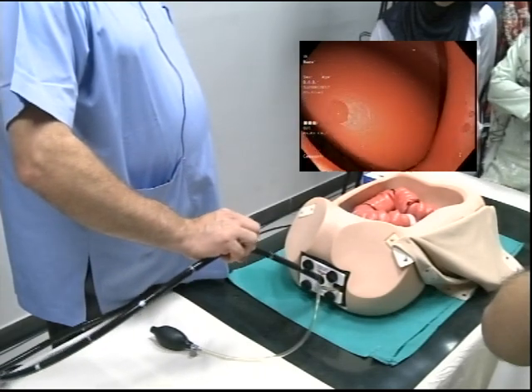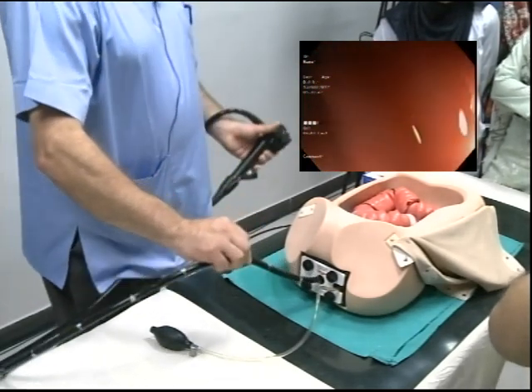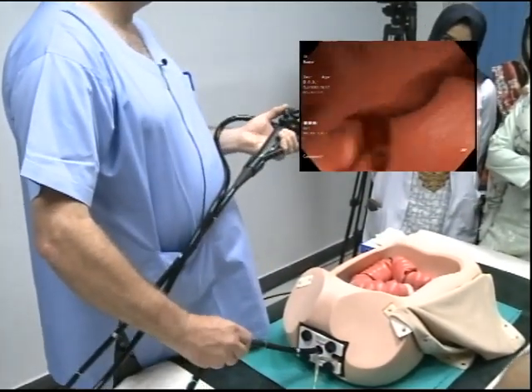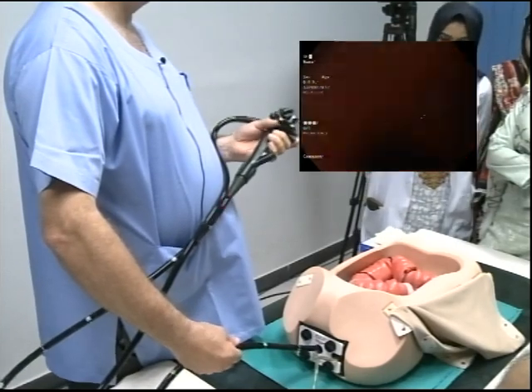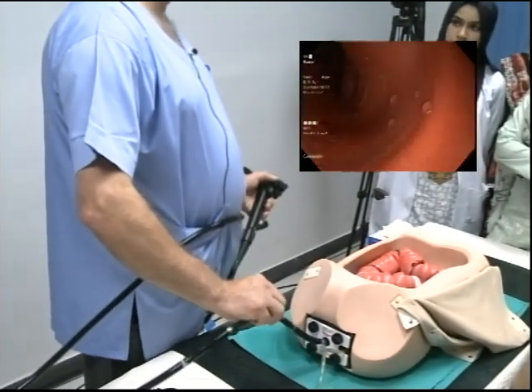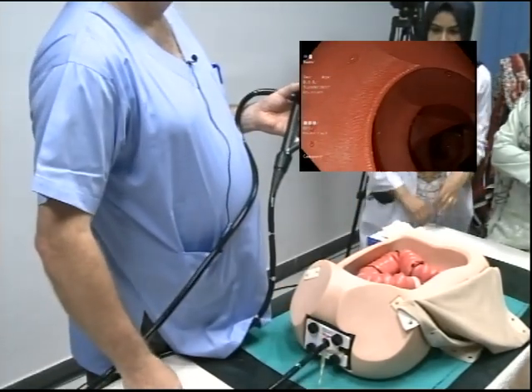Tip up and let the scope now come round. As it comes round, I now let the scope come back and sit on the bed. As it sits on the bed, the scope itself comes round and straightens. As it straightens, I then come anti-clockwise, clockwise and forward. Okay?